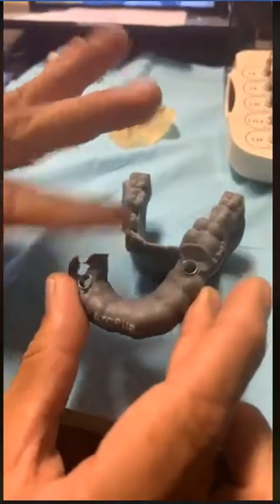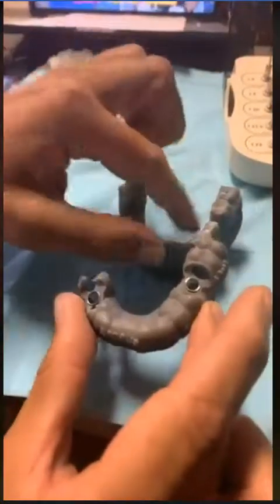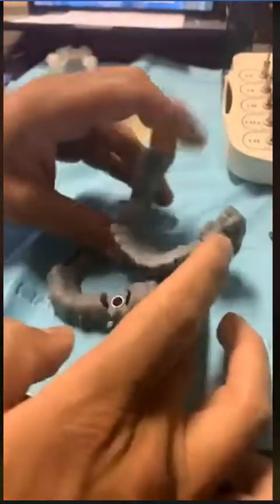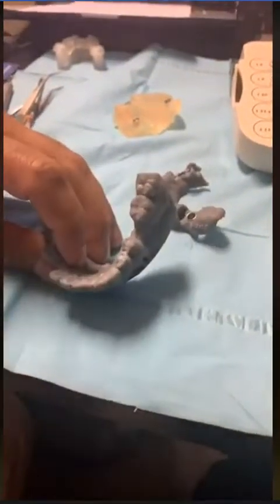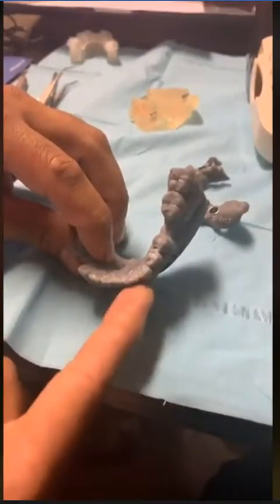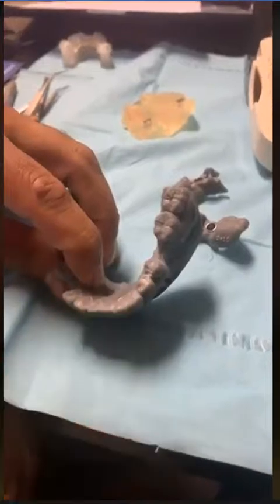I have made a guide for the patient. I apologize for this side. This side is a fracture side, but we're going to just do this side for now, okay? And you can do this yourself, and you could have us send this information to you if you choose, where we can send you the model of the patient with the guide, and you can do the surgery yourself first on the model.